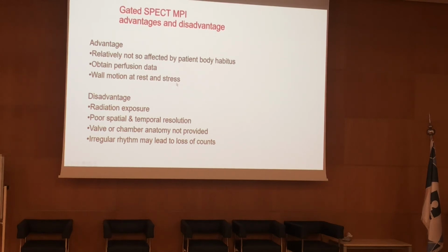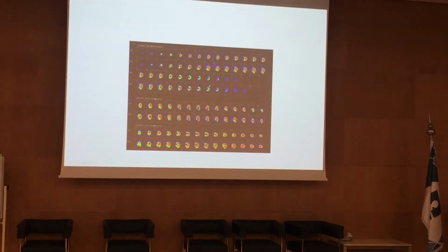We can assess the wall motion at rest and stress, and we can obtain the perfusion. So this is a typical example of SPECT. This is what we see. We do it every day in our hospital. We do these images. You know what it looks like.